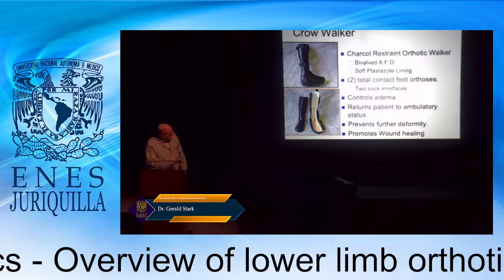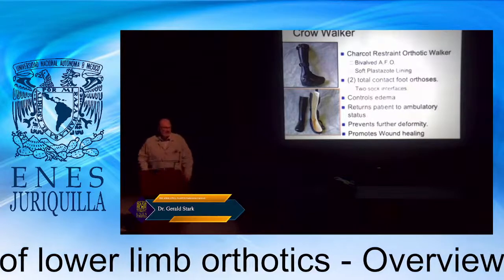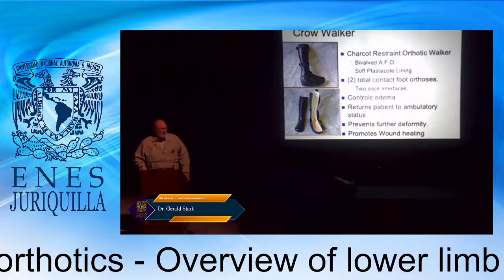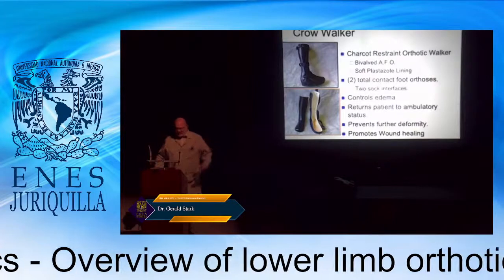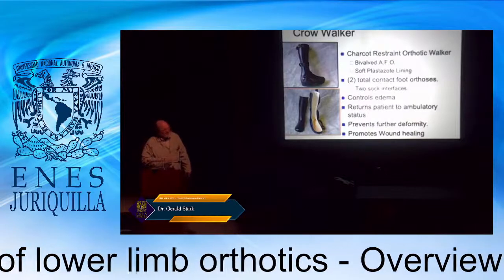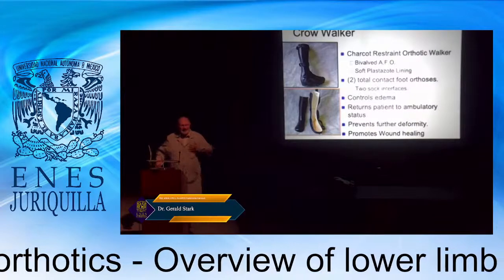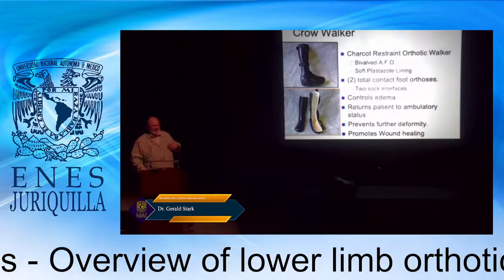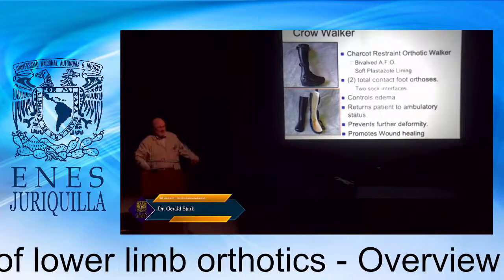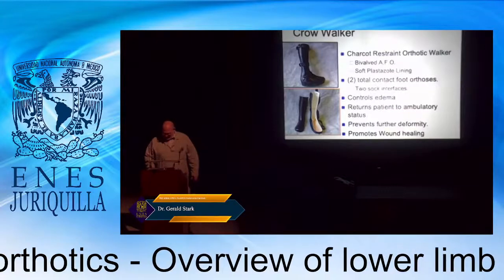So with this rocker bottom, we put the foot in there, and we don't necessarily need to wear a cast. We can be ambulatory. And due to something we know as Wolff's Law, the more we load bones as they're healing, the stronger and faster that fracture will heal. So if we have someone with a surgery of the midfoot, we put them in a CROW walker and they could ambulate. When I was younger, we used to make these custom made, and now you buy these basically off the shelf, but they don't necessarily always fit your shin. So sometimes I worry that they're not maybe the best, but they're what insurance will pay for.